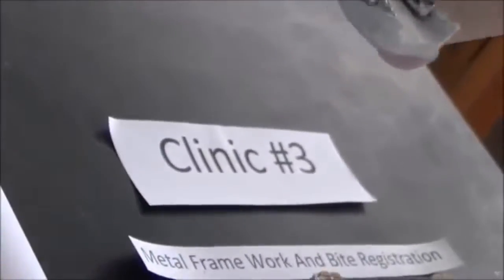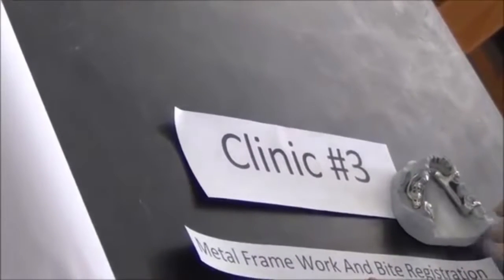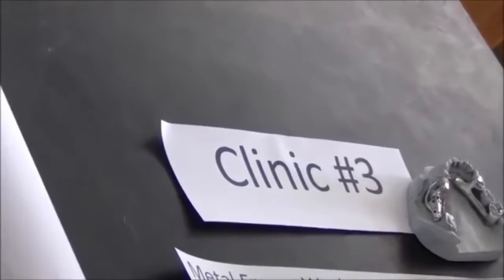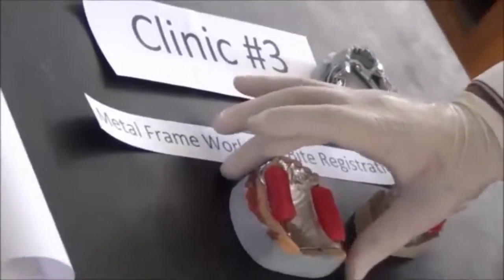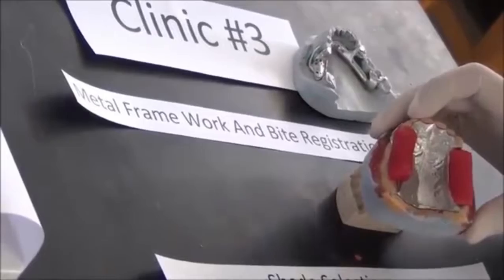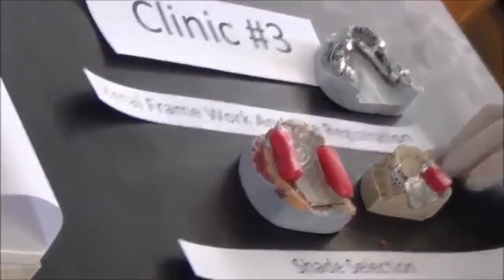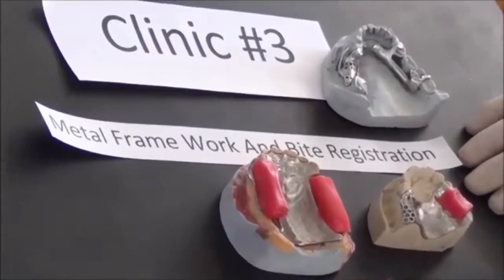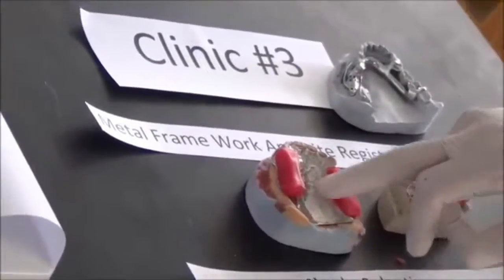So the dentist receives this metal framework, puts it inside the patient's mouth, tries it in, then takes a bite. The bite registration tells us where to place the occlusal plane of the teeth that we're going to select. I would like to remind you of the bite registration you have done in complete denture, because in the case of free-end saddle, this is very similar.